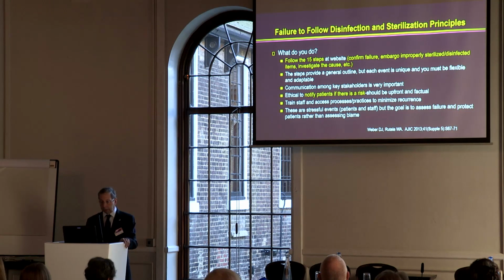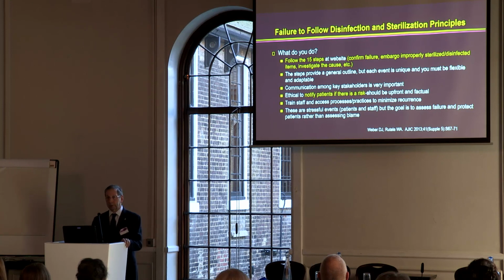It's certainly ethical and appropriate to notify patients, as I've said, if there's a risk. But there may be times where the risk is so low that you do not need to do that. And obviously the major goal, besides taking care of the individual patients who are exposed, is to identify and fix the problem so it doesn't occur again. Fix the individual problem that happened, and then fix the system so the problem does not happen again.